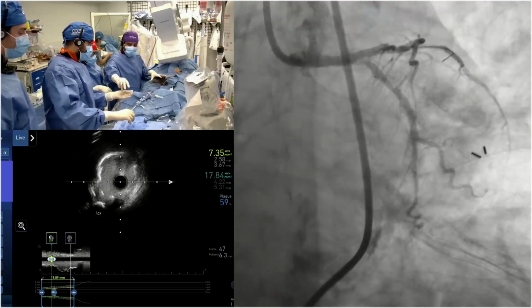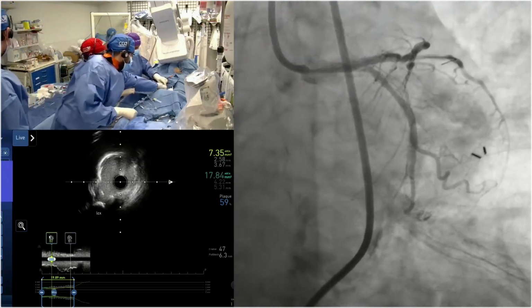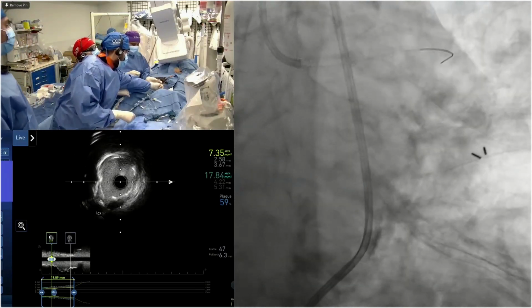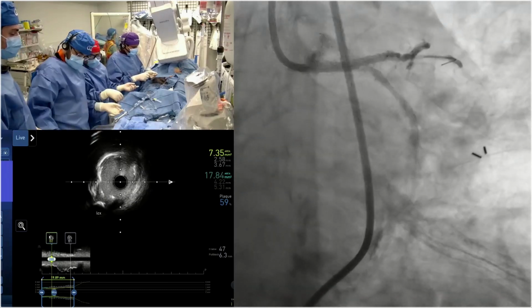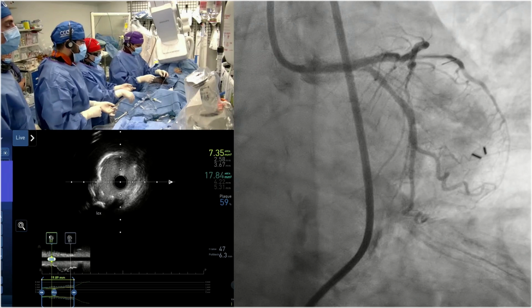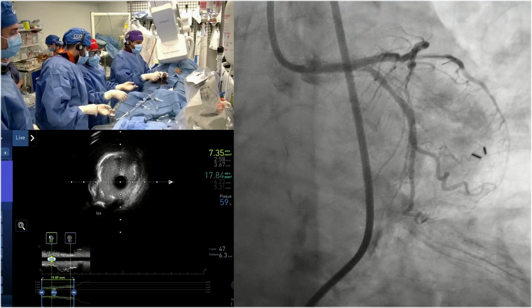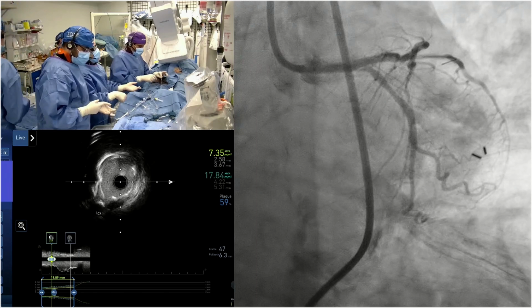If you don't mind, I'm going to go to the other room. Yeah, you go. No, you don't need to come back, just start your session. We have completely made all the points. Beautiful. We'll just do the kiss because of the ostial lesion. Although IVUS is not helping us in that way, we'll do it without it and just do a kissing.